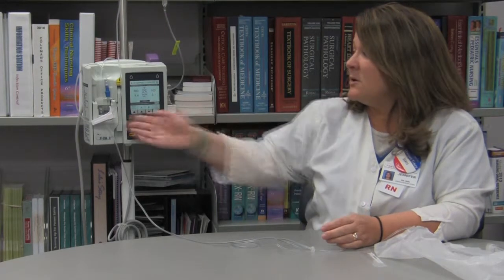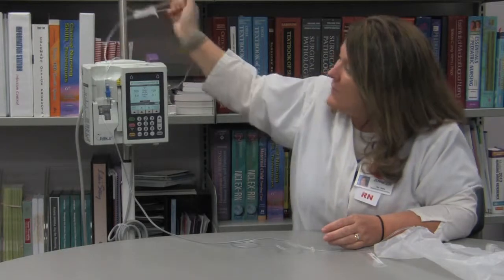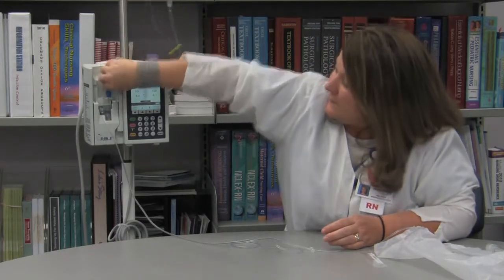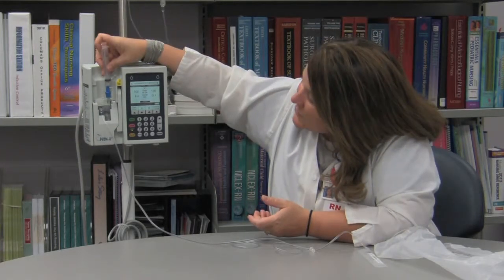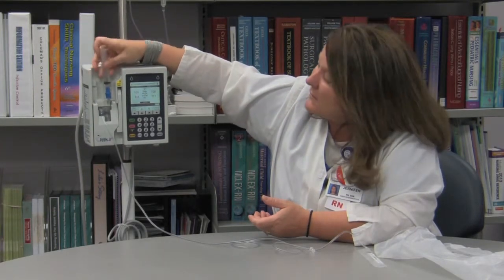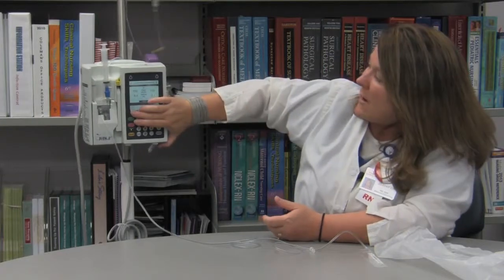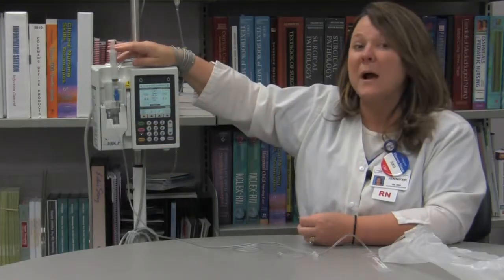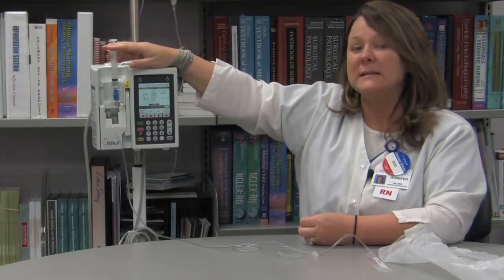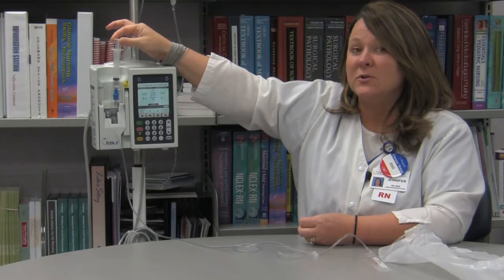If for some reason you don't have a secondary or a piggyback connected to your blue port and your pump is beeping air, then what you could do is get a 10 cc syringe. Again, scrub the hub really well. Put your syringe on to the blue port. Loosen that plunger just a little, and then you can back prime air out of your cassette into the syringe. So you can back prime either way, into your piggyback or into a 10 cc syringe. You would just never want to leave a syringe connected without a plunger attached.